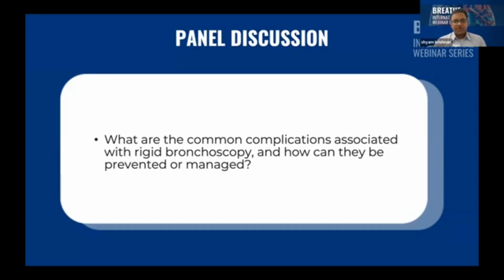So these are the common mechanical complications which can occur, and obviously airway fires, all that you need to make sure it doesn't happen. Lower the FiO2 when you're using hot therapies. So bleed, these are the mechanical complications.